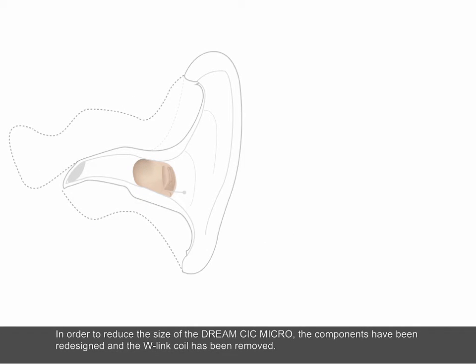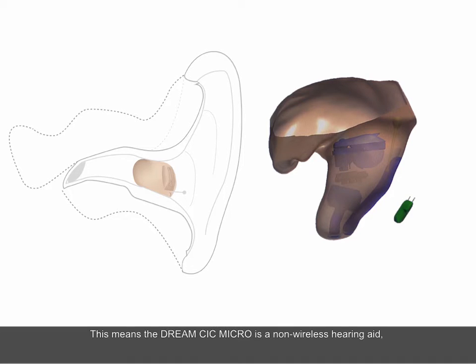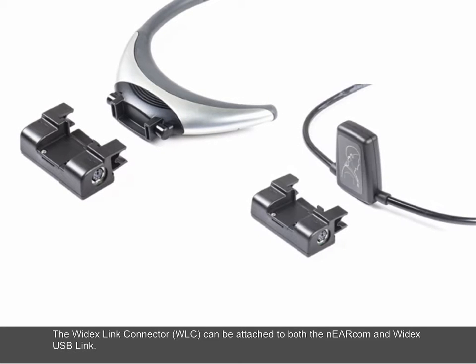In order to reduce the size of the Dream CIC Micro, the components have been redesigned and the V-Link coil has been removed. This means the Dream CIC Micro is a non-wireless hearing aid, and you must therefore use the new Widex Link Connector to connect the hearing aid to Compass GPS. The Widex Link Connector can be attached to both the Nearcom and Widex USB Link.